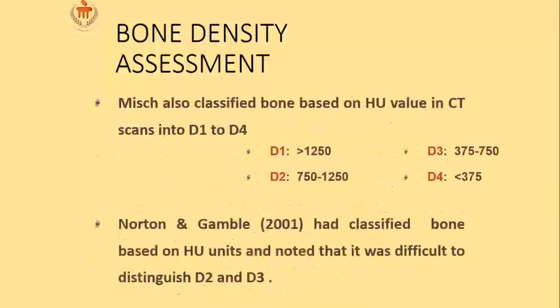What's a D1, D2, D3? Essentially, with D1 and D2, just close your eyes and place implants. D3, D4, you're actually thinking twice. Is it okay? Not okay? D4, I would say no. D2, D3, okay, but D1 and D2 is pretty okay to place implants.